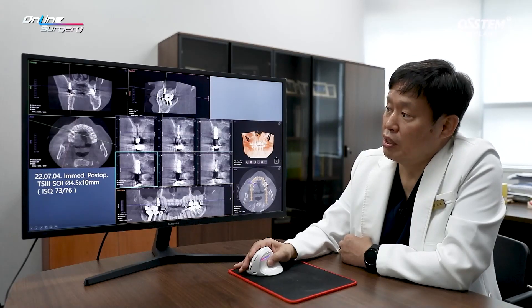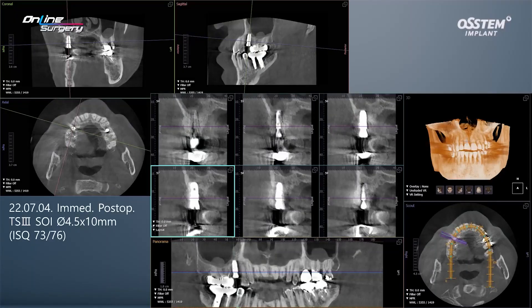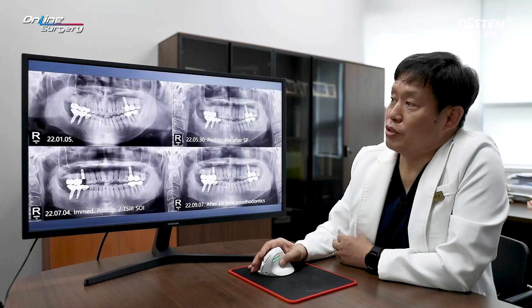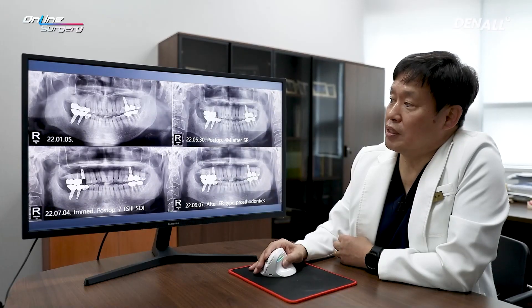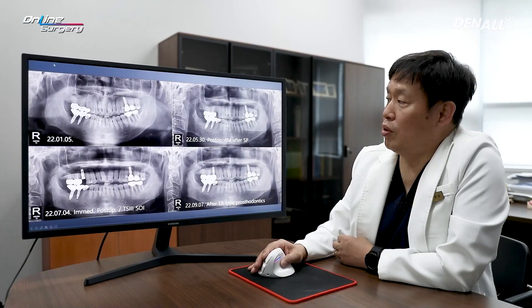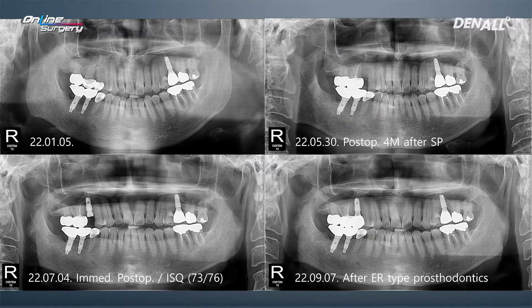This is the immediate post-op CT image. In the area where socket preservation was done, additional bone graft was done. This is January of this year when socket preservation was done. This is the 4-month follow-up.